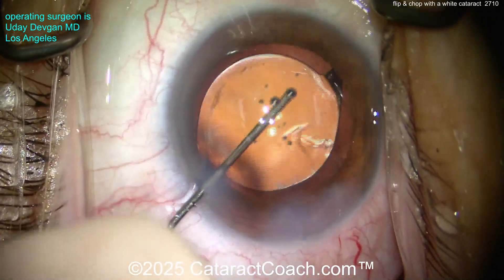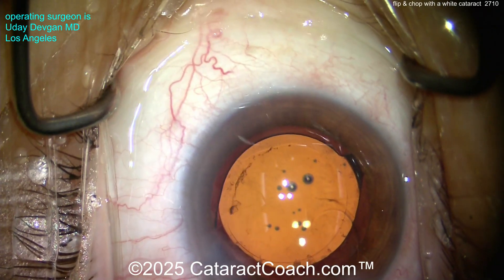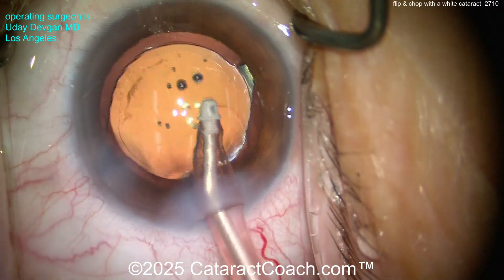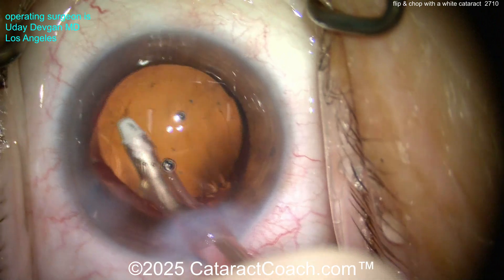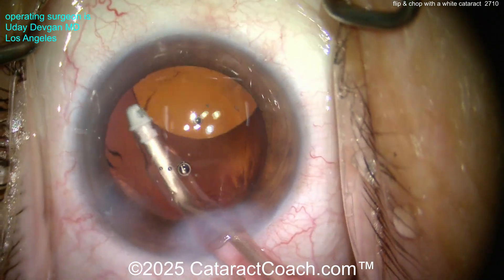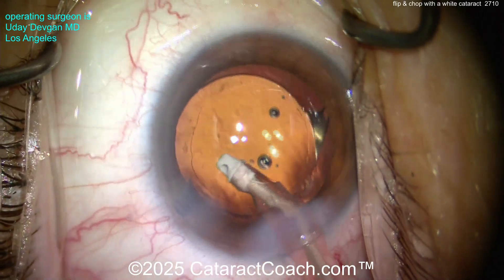This patient is going from light-perception vision to clear vision the next day — they're going to be really happy. Going back in with the probe, there's some viscoelastic to clean up. You may be tempted to go behind the optic to get some of that filamentous lens material. I'll try — maybe a little bit — but the balance here is don't break the bag.